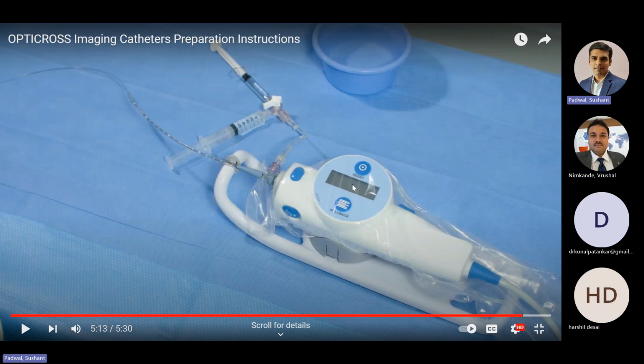So that level of precision is there. The moment you see a 30 mm length here, that means 3 dots are out of this red marker. So you can still rely on these dots also for doing your measurement.